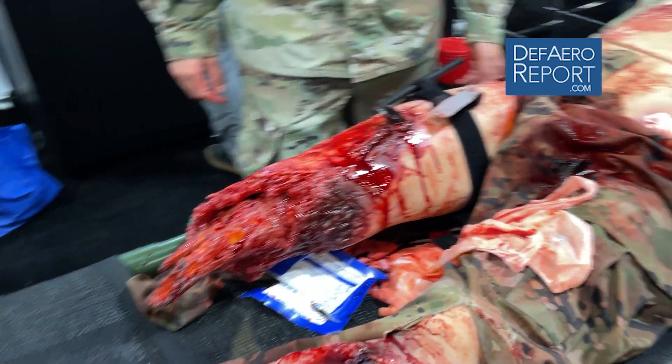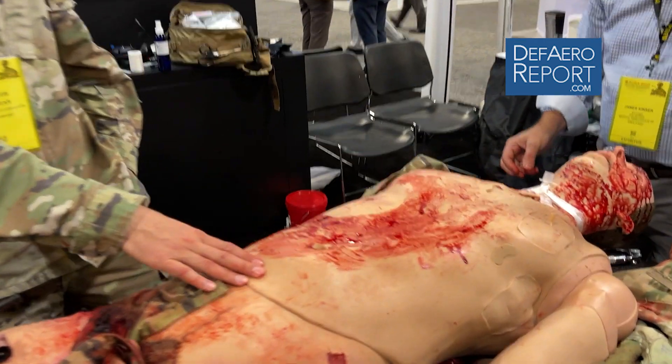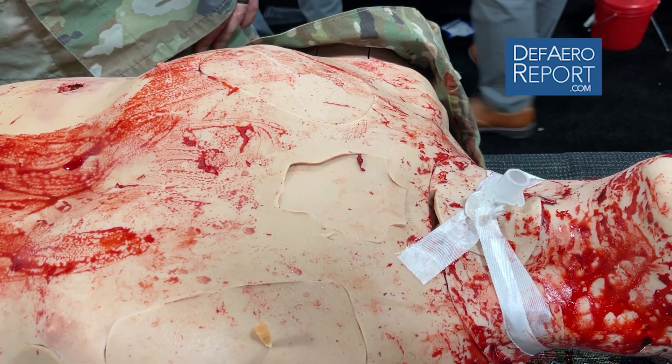Over the last 20 years of war, we know that almost a quarter of our combat casualties were preventable had we done the right thing at the right time. This mannequin is currently available at 41 training sites that can be signed out from the TAS-C by medics that are trained to use it. There are 77 of these out there.